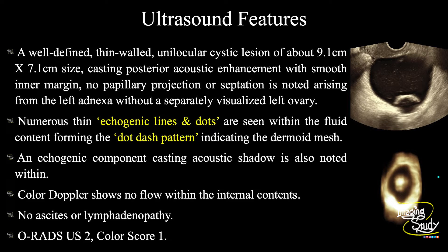In summary: a well-defined thin-walled unilocular cystic lesion of about 9 cm by 7 cm casting posterior acoustic enhancement, with smooth inner margin, no papillary projection or septation, arising from the left adnexa without a separately visualized left ovary. Numerous thin echogenic lines and dots forming the dot-dash pattern indicate the dermoid mesh. An echogenic component casting acoustic shadow — probably a molar tooth — is also noted. Color Doppler shows no internal flow and no prominent peripheral flow. No ascites or lymphadenopathy. Conclusion: left adnexal dermoid cyst with O-RADS score 2 and color score 1.